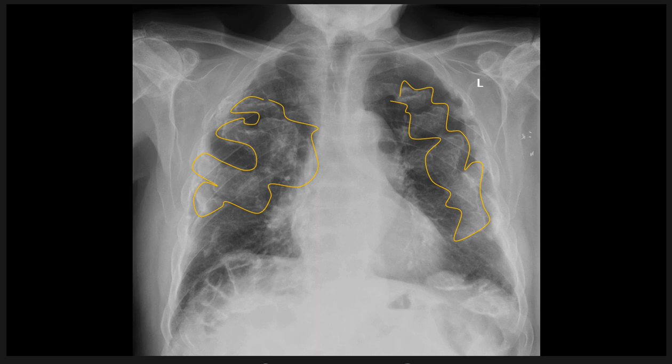The actual development of mesothelioma is pretty rare. It's extremely rare in people who haven't been exposed. It's more common in people who have, but even in people who have been, the typical look is this calcified pleura. If it was something that looked mass-like or was bothersome to you, obviously you could get a CT to investigate further.